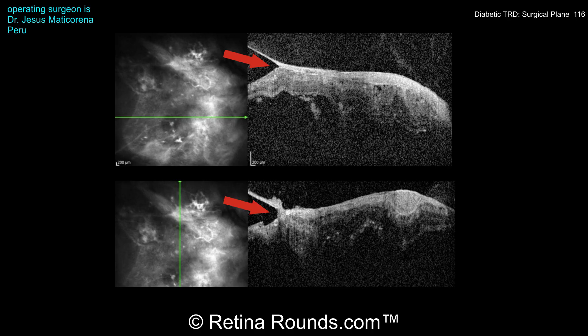When the view permits, preoperative OCT can also be helpful to identify areas where a partial PVD is present. In the upper horizontal scan through the macula, we can see a broad area of vitreoretinal adhesion detaching the macula. However, the arrow points out a separation between the hyaloid and the underlying retina, which is the correct plane for dissection. The bottom vertical scan also shows a similar finding in the inferior macula, which is again the correct surgical plane.